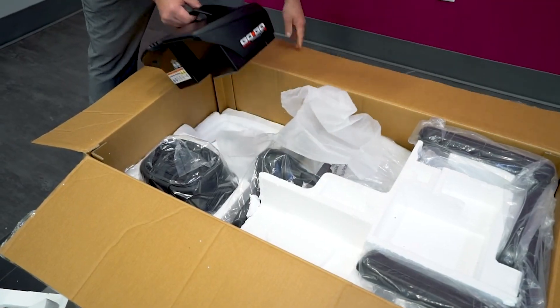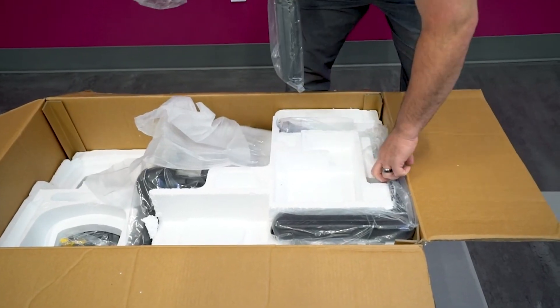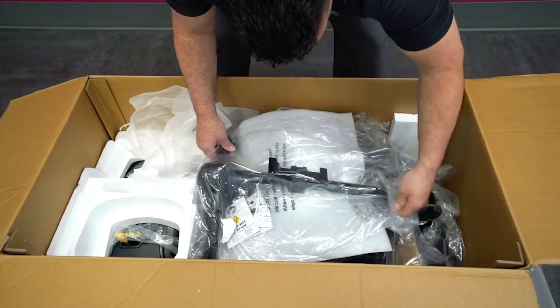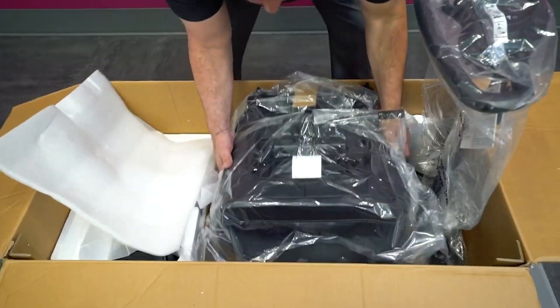Continue to remove the contents, including the battery pack, the front basket, and the armrests. Be sure to loosen the tiller by using this knob and unfold the tiller, then remove the seat.